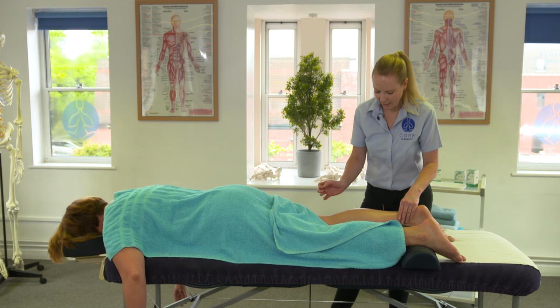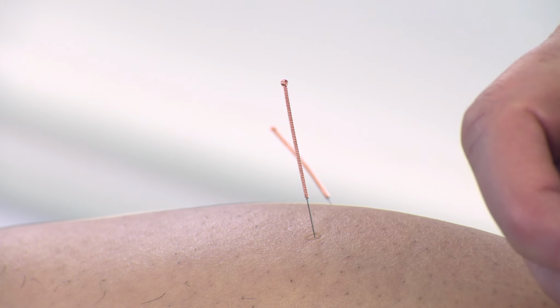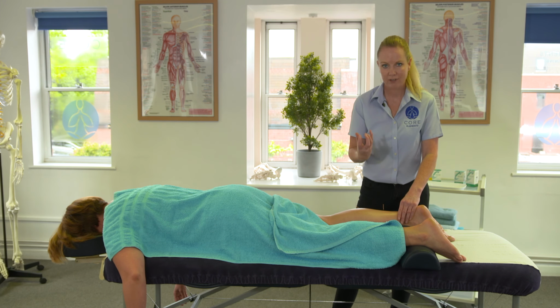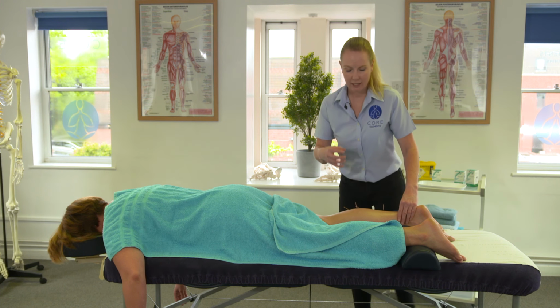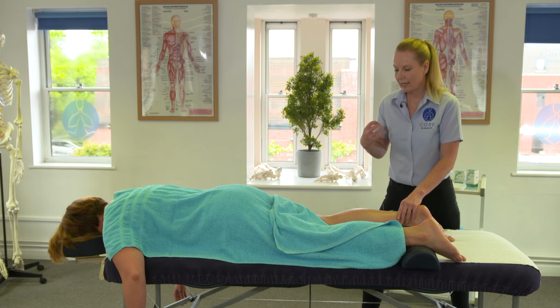Slightly. Okay. If our client didn't feel anything at this stage, then what we could do is our turning method as well. So we're just turning that needle slightly in order to wind some of that fascia up and increase that sensation around the area. And the final technique that we're going to do here is our peppering technique. And sometimes that's great for helping to stimulate a twitch response.